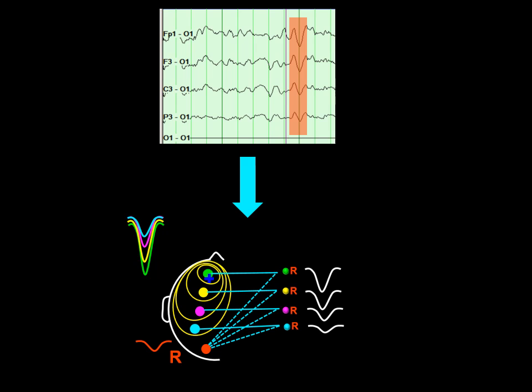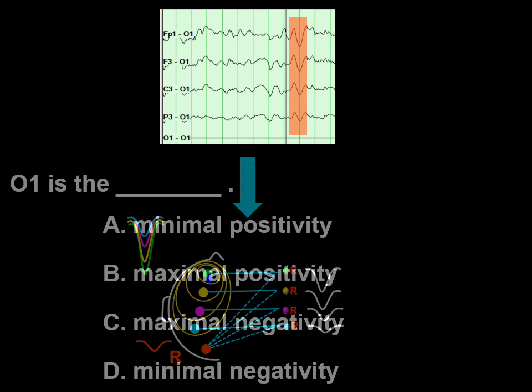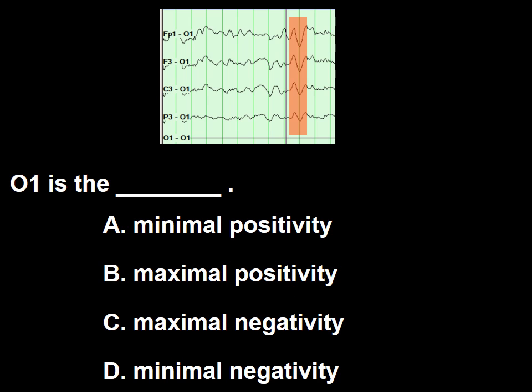The choice in this case is easy, since I think that from the very beginning you recognize this activity for what it is, eye movement. Yet, from the point of view of sequential thinking and thinking process, it is important that we remember all the assumptions to which we have alluded. So the answer to this question is A.